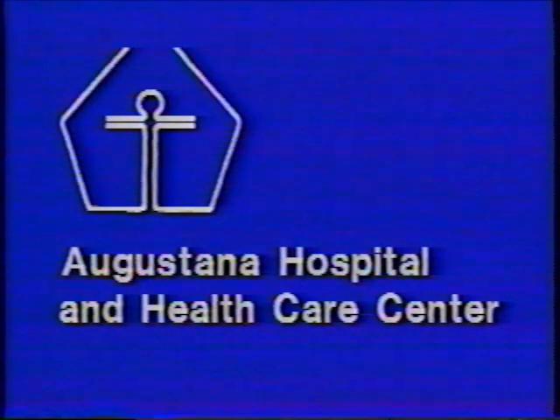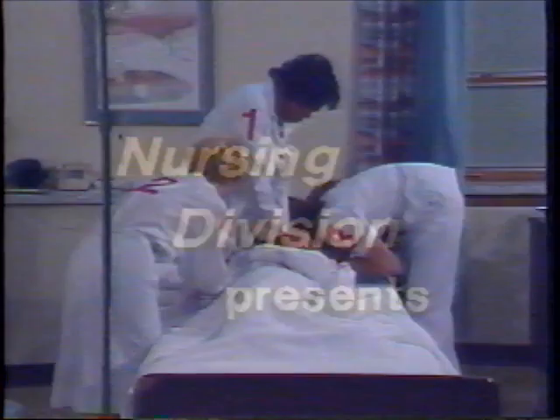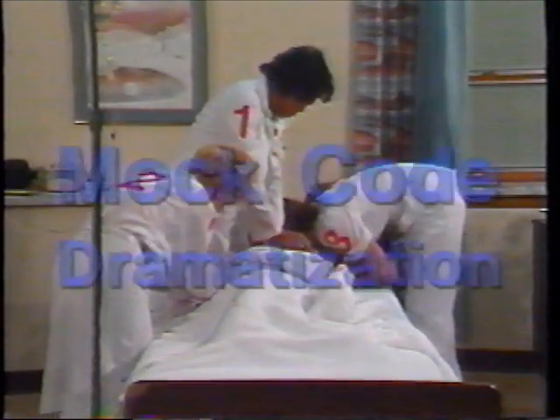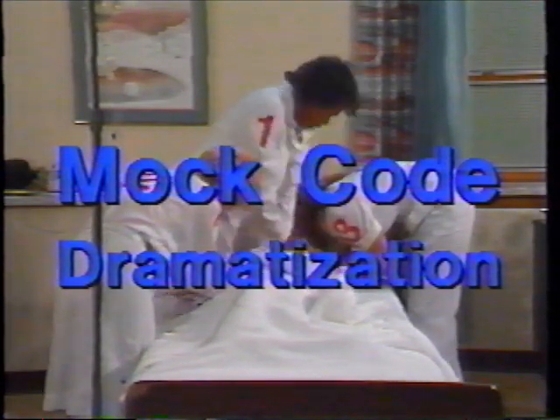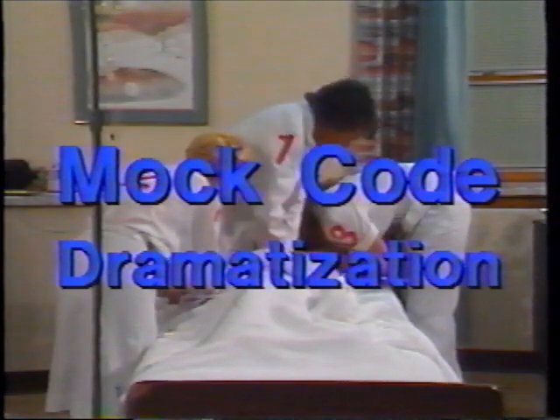Stop compressions. No pulse. 1, 2, and 3, and 4, and 5. Change.